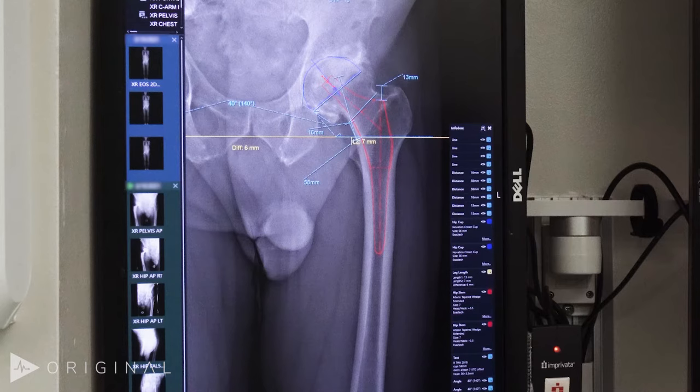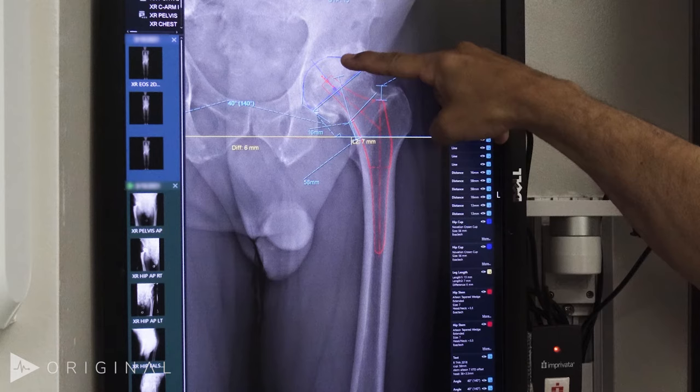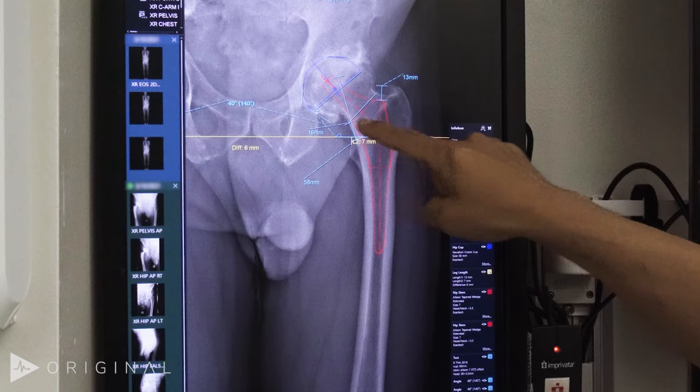We can see we're seeking to put the socket at the anatomic points of the superior subchondral bone, the teardrop medially, and inferiorly just below the teardrop.